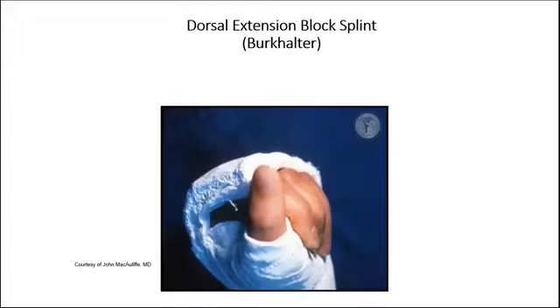It is a splint that is usually formed of two slabs, an anterior slab, which reaches the distal palmar crease, and a posterior slab that goes all the way to the PIP, the IP joint. It allows full extension of the fingers.